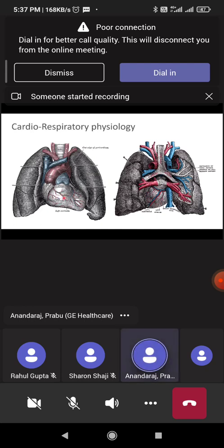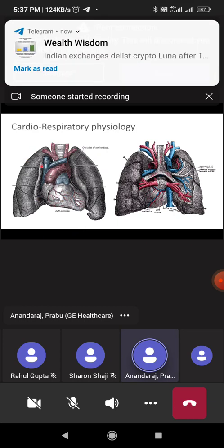In many instances, you would have seen in the field that when they increase the PEEP in the ventilator, there is a concomitant impact on the blood pressure. So when the BP is falling, one of the things the clinicians will do, other than the medical management, is try to reduce the PEEP so that the intrathoracic pressure comes down and more blood starts flowing into the heart.